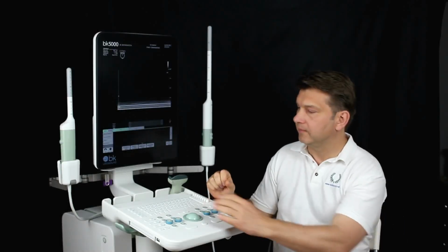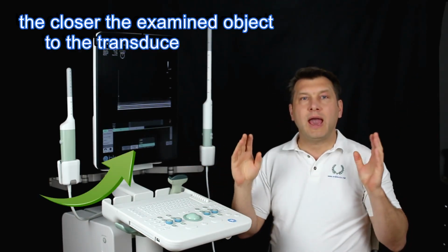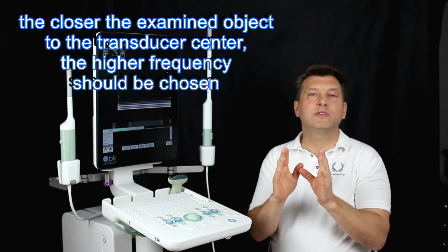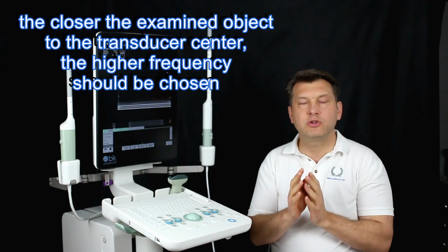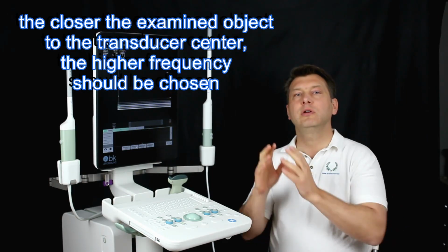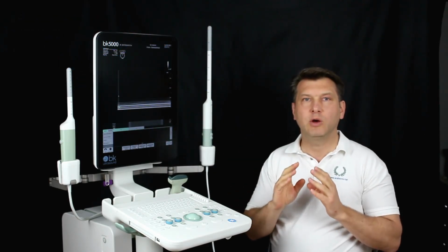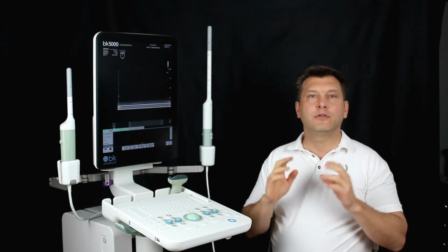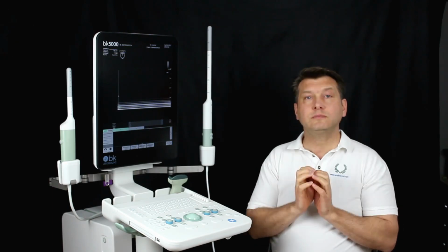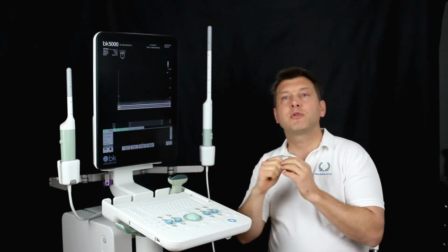The frequency, we can choose it here, and what we should know is the closer the examined object to the transducer center, the higher the frequency should be chosen. For the assessment of the anal sphincter, the highest possible level, for example 14 MHz at this probe and 16 MHz in this one, should be chosen. For another view, we should choose between 9 and 10 MHz. This allows us to show structures that are farther away from the probe properly as well.